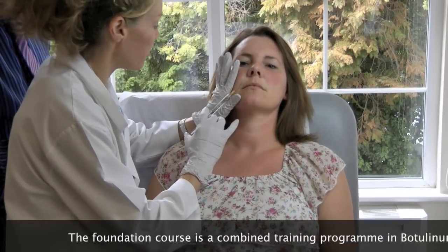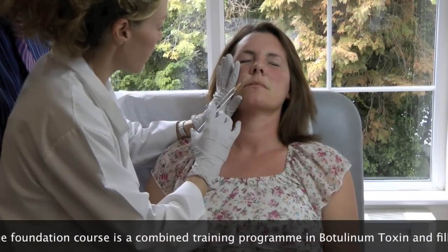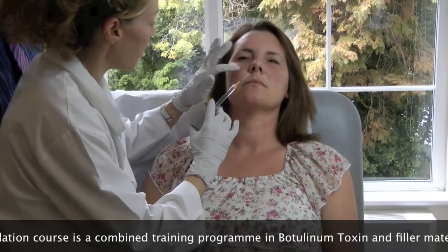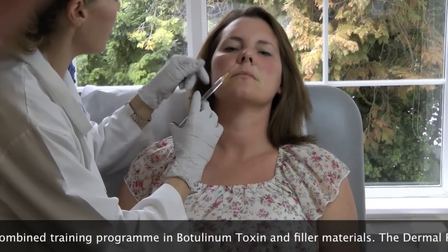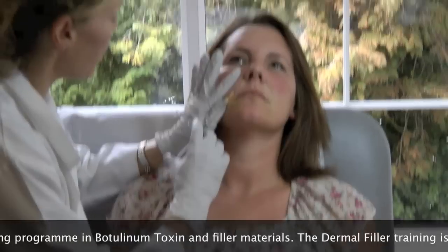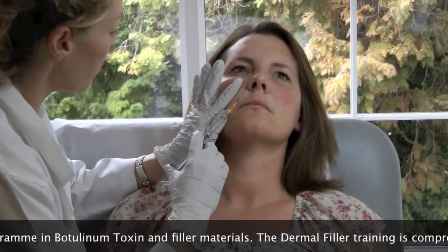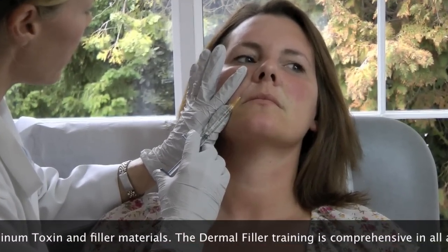And as soon as I'm going to see the bevel just under the skin, I'm going to level off. And then I'll just check — so you can see where we are, but you can't see the colour of the needle. And then just start to inject, and see the skin coming up.